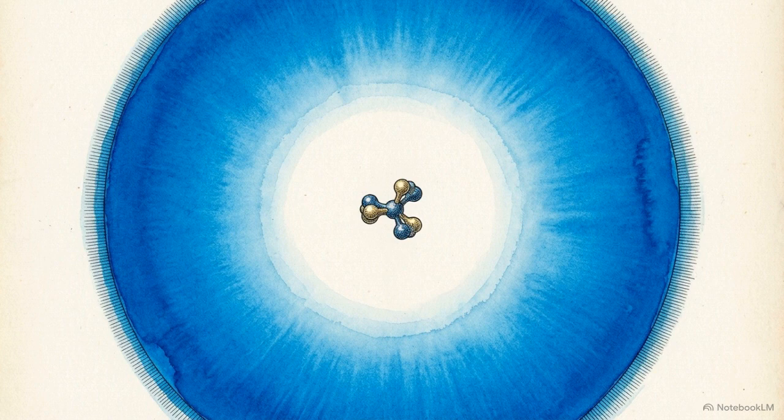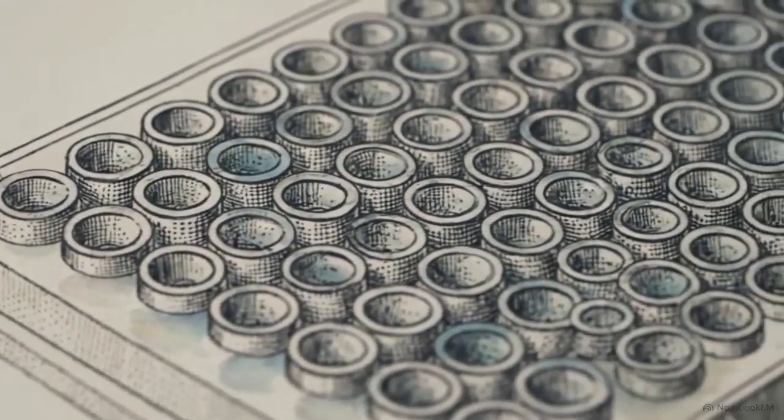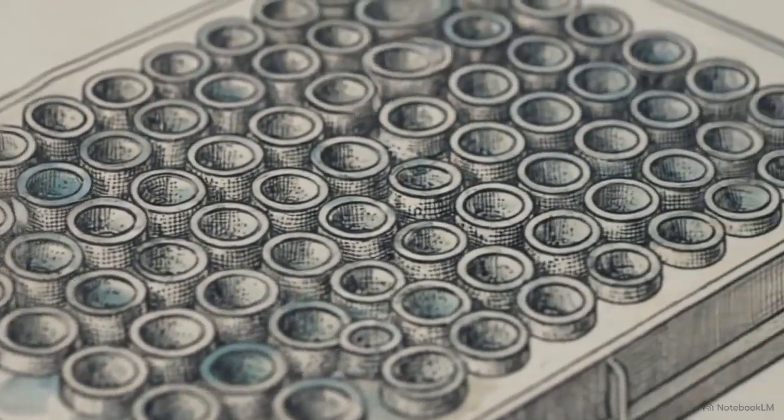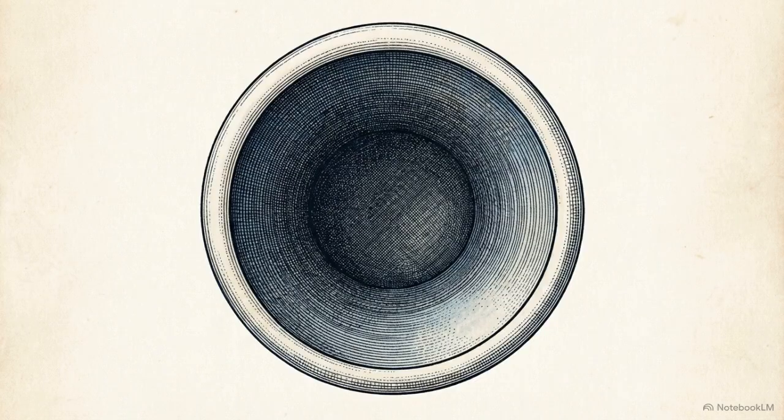Because an antibody binding to an antigen is microscopic and invisible to the naked eye, we have to find a way to make that event measurable. We achieve this through engineered signal amplification. The physical foundation for this engineered signal amplification is the enzyme-linked immunosorbent assay, commonly known as the ELISA. This process usually takes place inside the tiny wells of a standard 96-well microtiter plate.